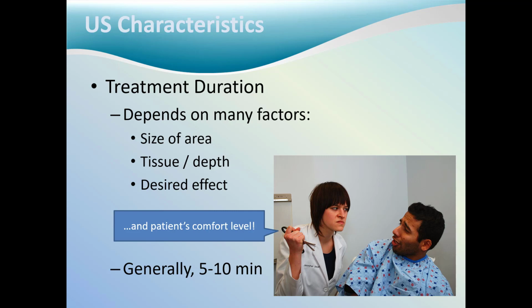The factors that have been discussed really are important to determine the proper amount of treatment time for a treatment. This is one of the major issues with ultrasound. Many clinicians do not dedicate the proper amount of time to treatments to reap the desired effect, and therefore the treatment is largely ineffective.